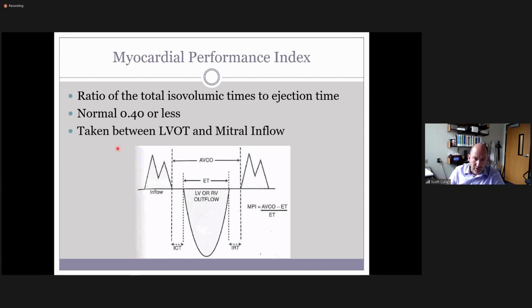That's an easy one though. It's just a simple, straight up and down, for placing the caliper accurately and such. Dampen your gain, stuff like that, just to accentuate what's going on. But that one's a pretty easy one. It really depends on your lab.